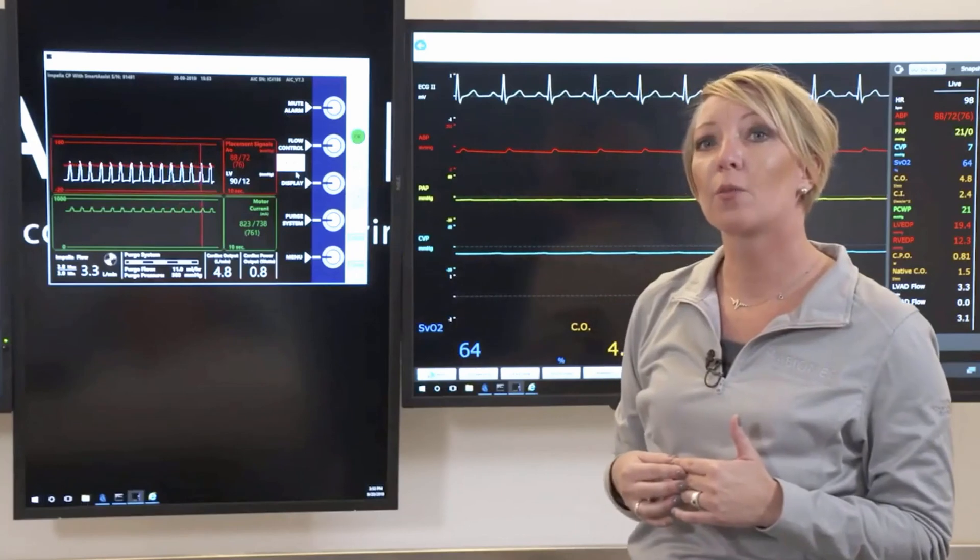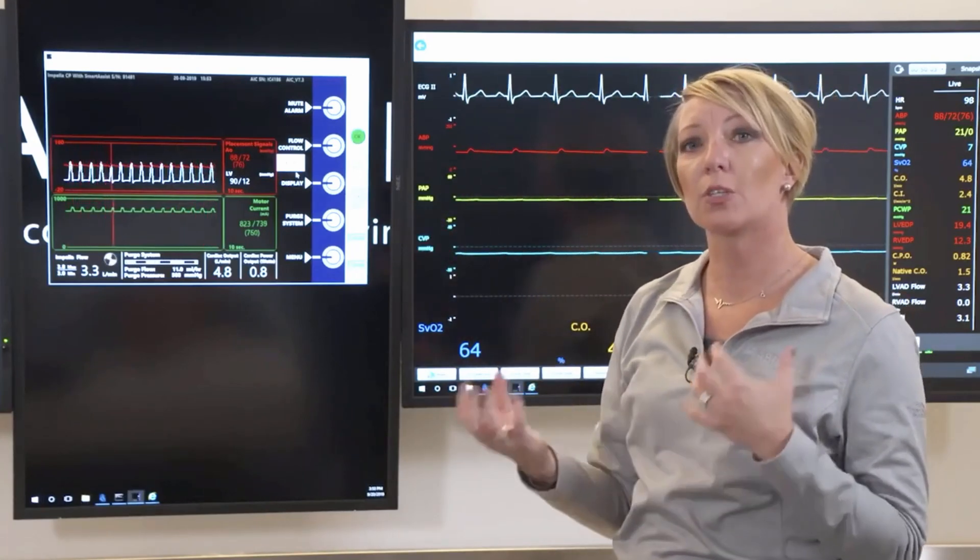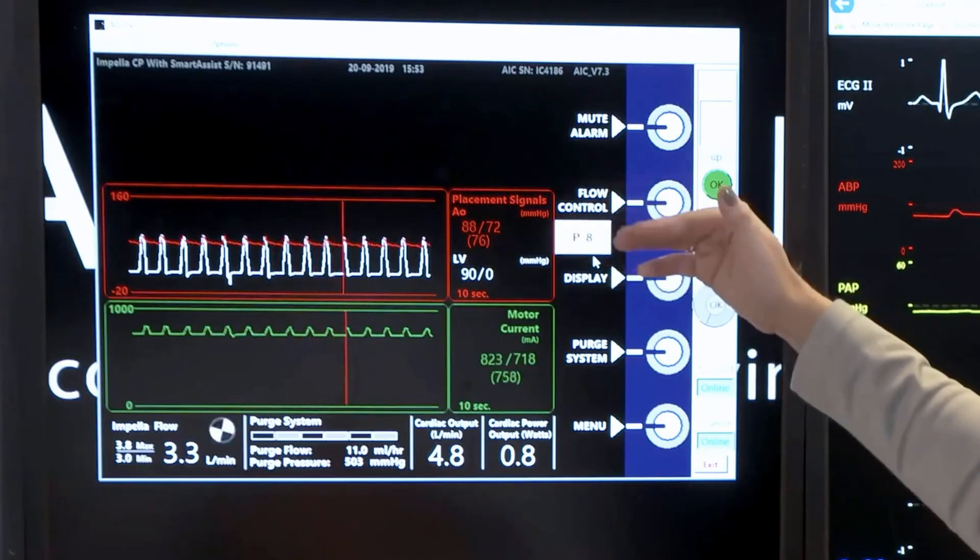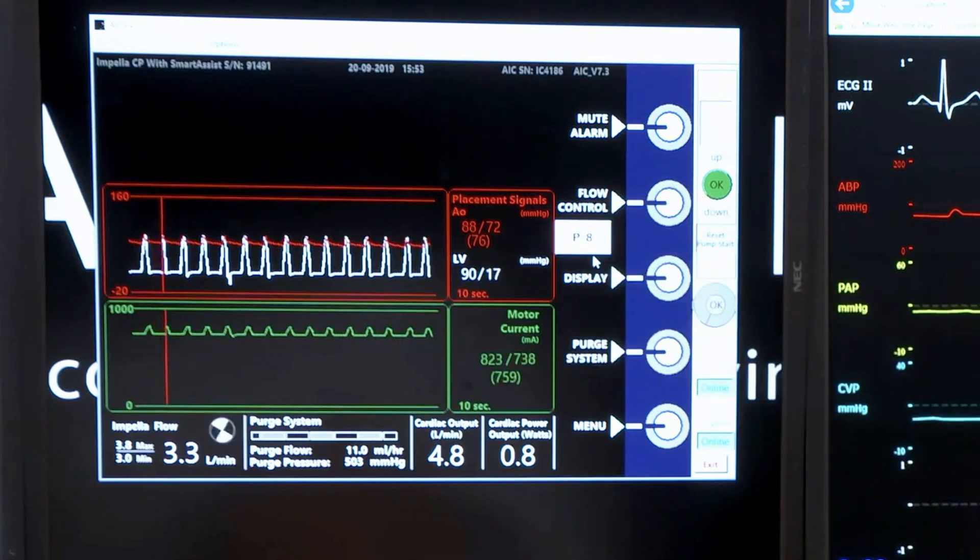You'll also notice that we have a red waveform or our placement signal waveform. This is going to give us two different waveforms: the AO waveform and the LV waveform. The AO waveform is simply from that optical sensor.